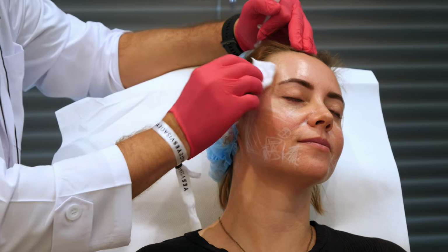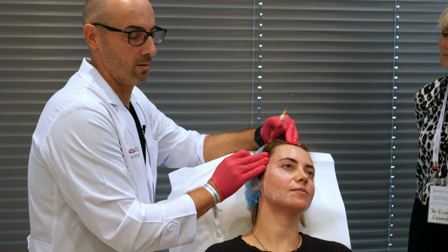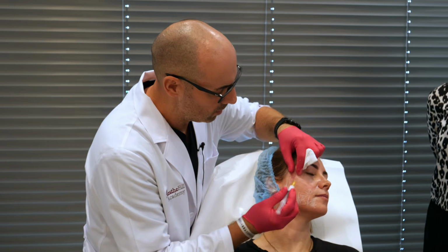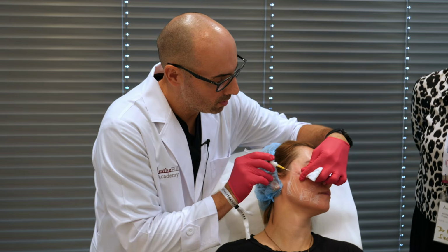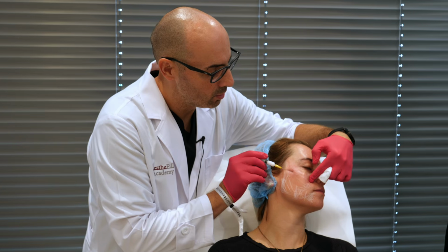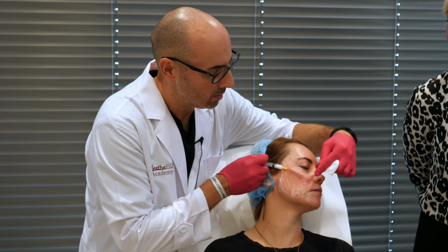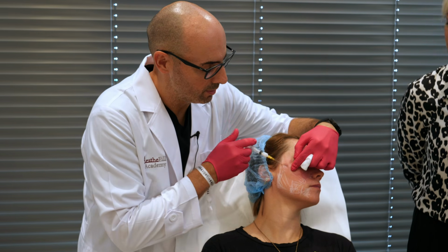Okay. Do you know that the treatment of the temple gives us a little lifting effect in other thirds? Go down. From the same point, slow, we go to the malar, anterior malar, and retrovectors.